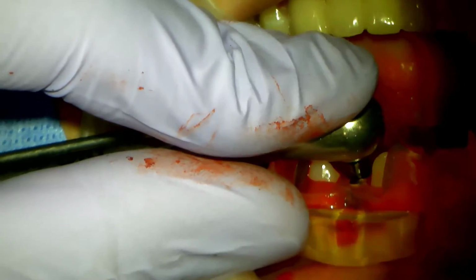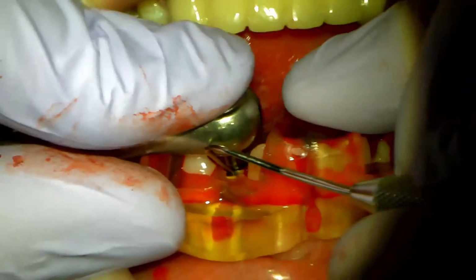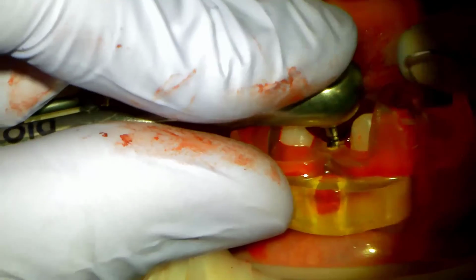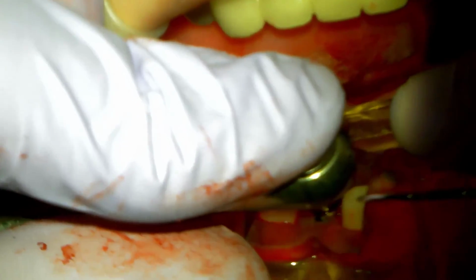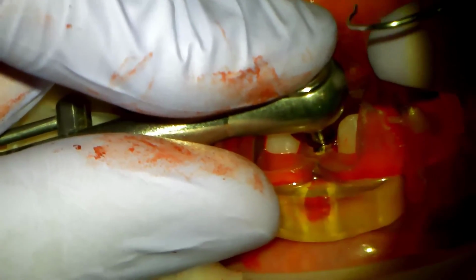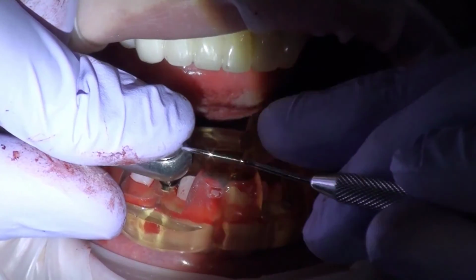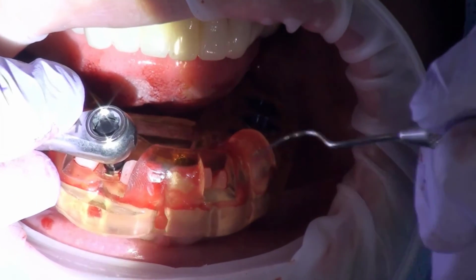This is a really important part of this procedure. This right here, this little indicator here to there has to line up with the indicator on the driver right there. And so as you can see, that looks nice and lined up. I like what I'm seeing there. This side is lined up perfect. That one's a little short for some reason, but I think we're really, really close. I might move it just a smidge right there. With that lined up, the hex rotation of the implant is going to match the hex of our custom abutment. So I really like that.